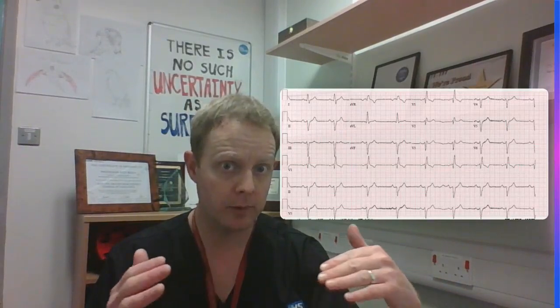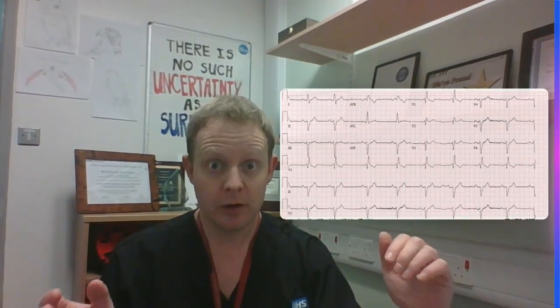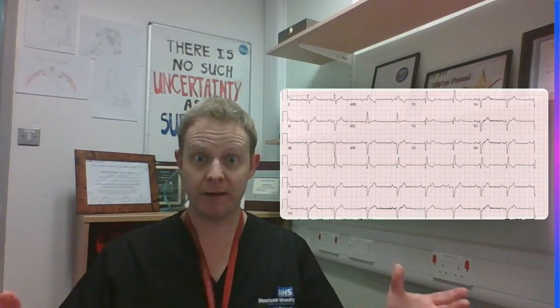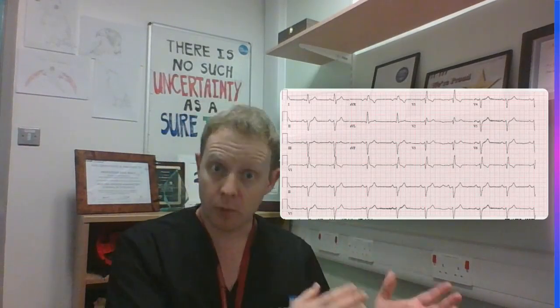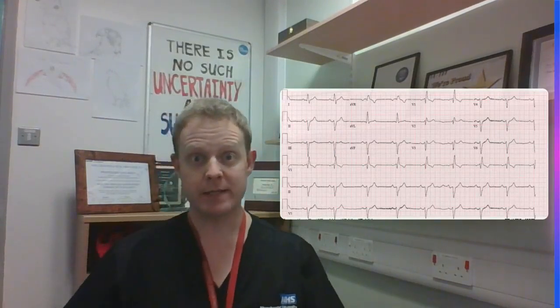So what's the axis? We look at lead one and see if the QRS complex is predominantly upwards — and it is. Then we look at lead two — it's predominantly downwards, so that means we've got left axis deviation. Right bundle branch block plus left axis deviation tells you you've got bifascicular block. There are three fascicles: the right bundle branch, the left anterior fascicle, and the left posterior fascicle. Block the right bundle branch and one fascicle on the left and you've got bifascicular block.